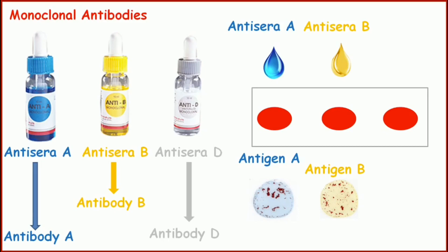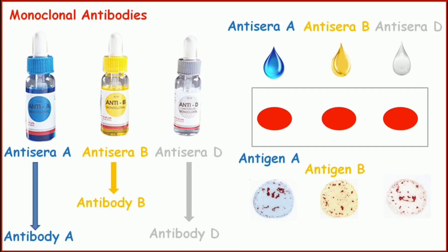Now for the third drop of blood, we add antisera D and mix well. If after mixing we see agglutination or clumping, then the anti-D antibody in the antisera D reagent has reacted with the RH antigen or antigen D and showed visible agglutination. As a result, we can say antigen D is present in the blood, or that RH antigen is present.